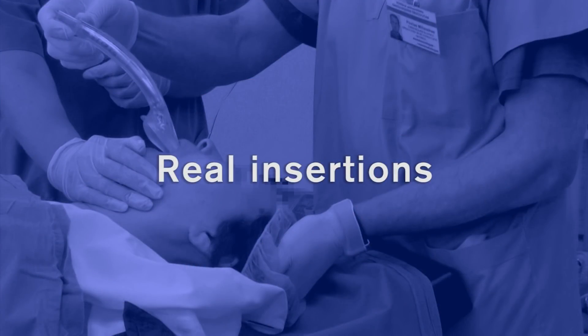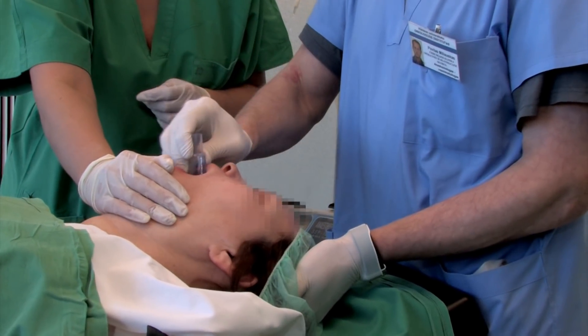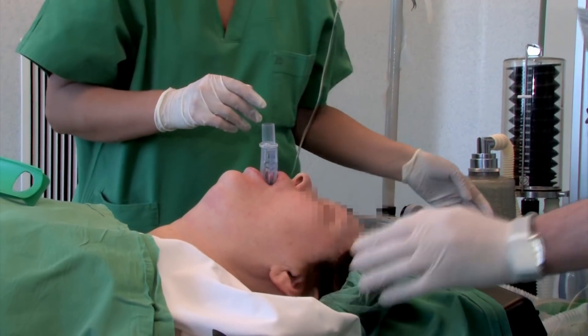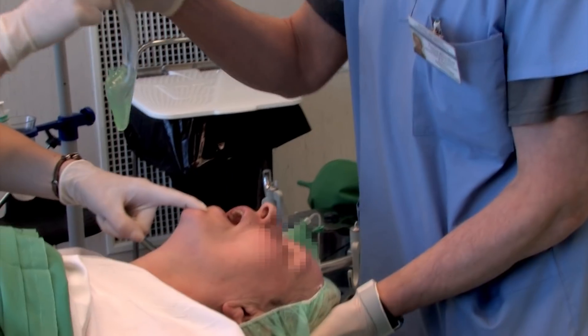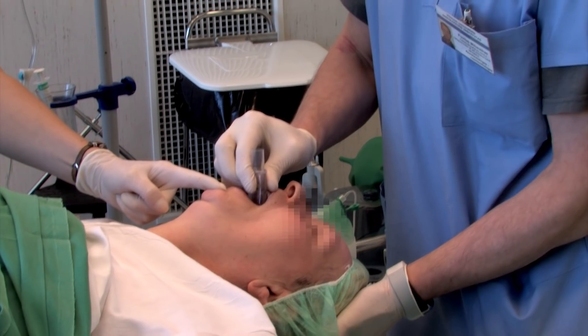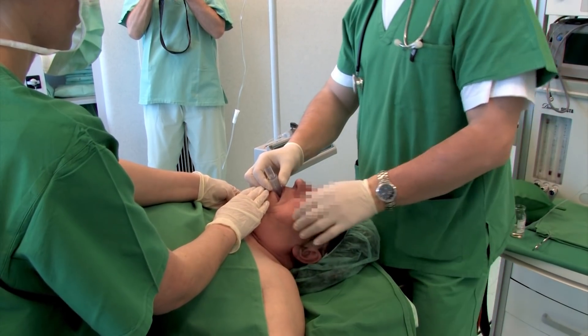Let's look at some iGel insertions in real patients. Note the sniffing the morning air position and the gentle press down on the chin — see how there is no need for fingers to be inserted in the mouth. There is never a need to apply excessive force or to repeatedly push down on the device once definitive resistance has been felt.